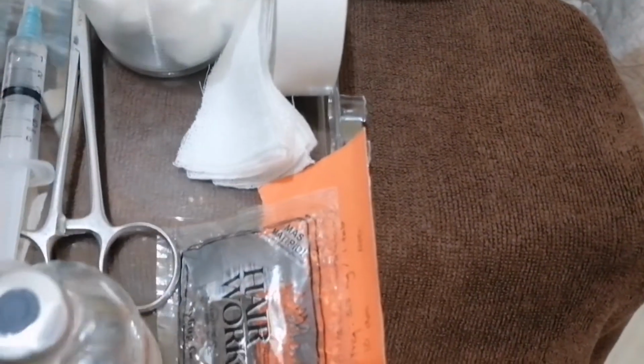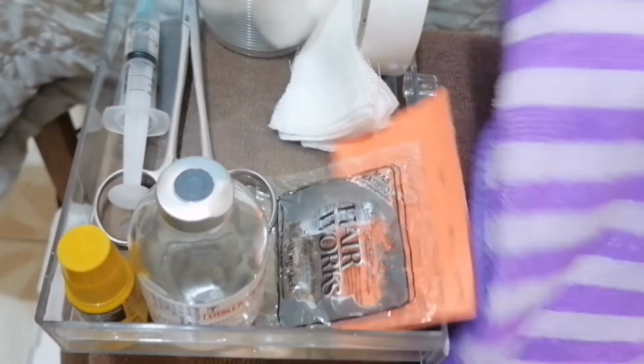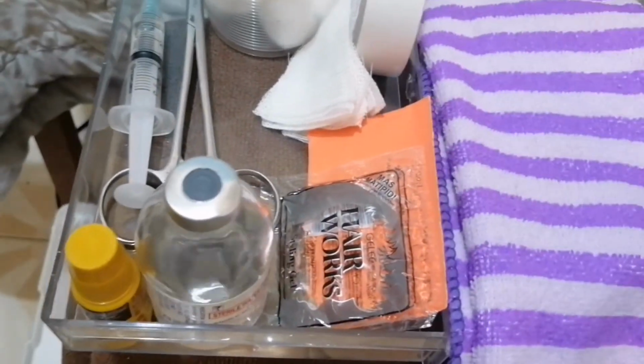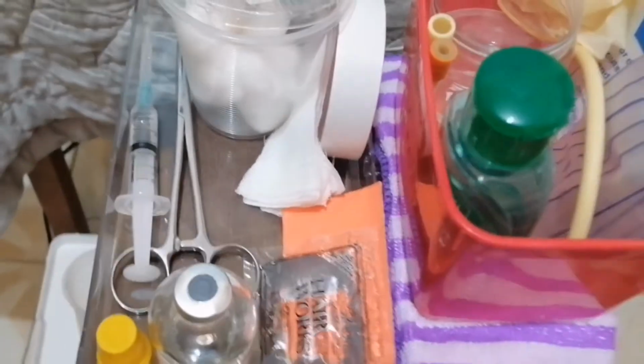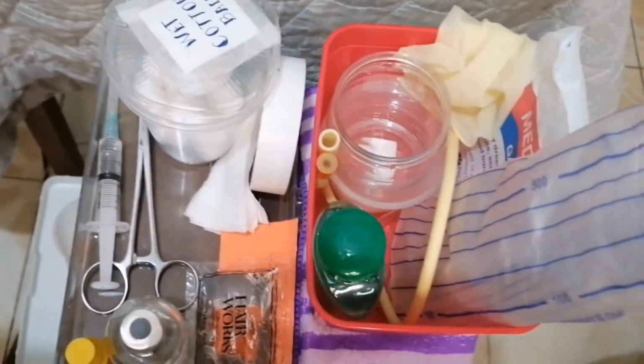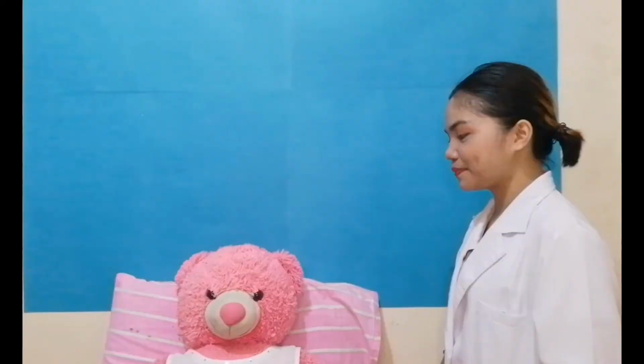Next is to assemble the equipment needed. Organization promotes efficient time management. So the next procedure is to identify and explain the procedure to the client. This ensures the right client and elicits cooperation.